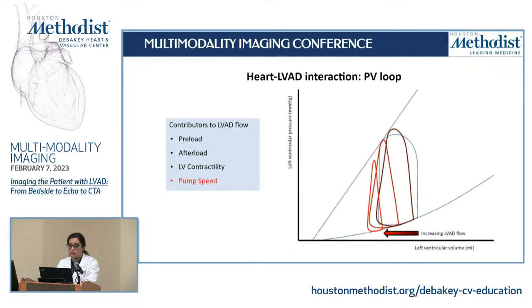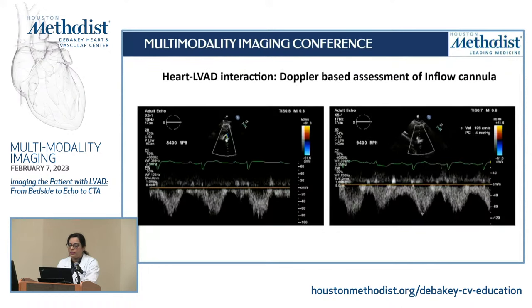This is what the PV loop looks like as you increase the LVAD flow. This was a question on my cardiology boards.